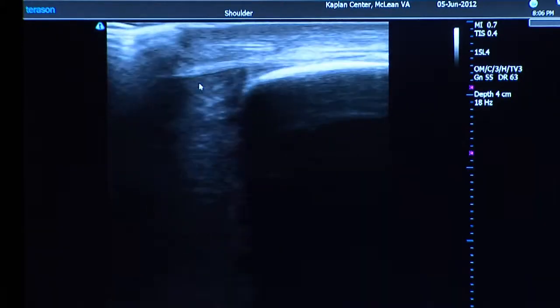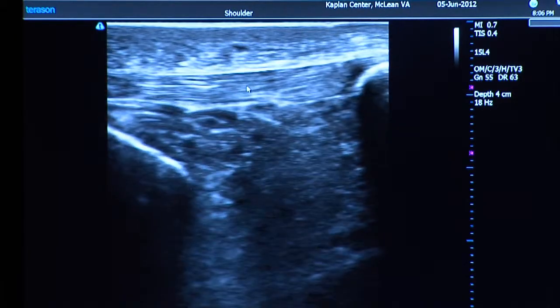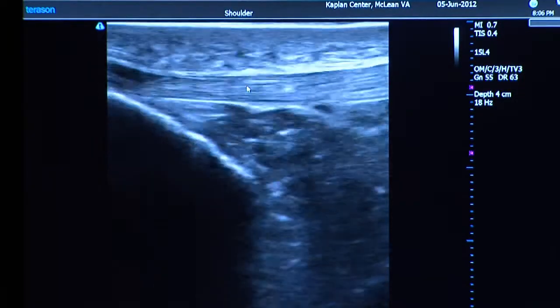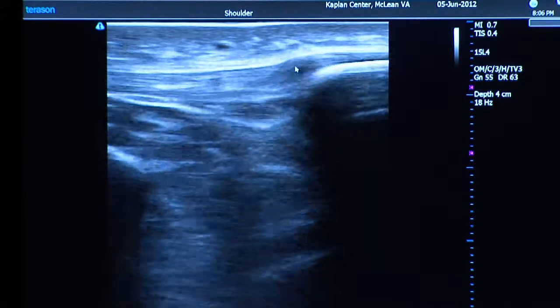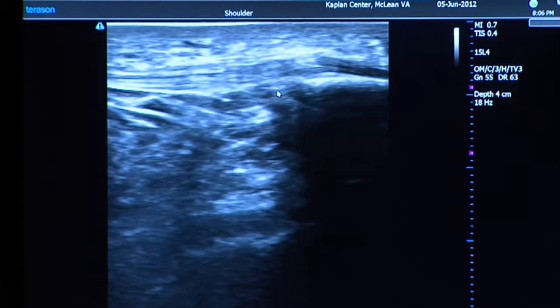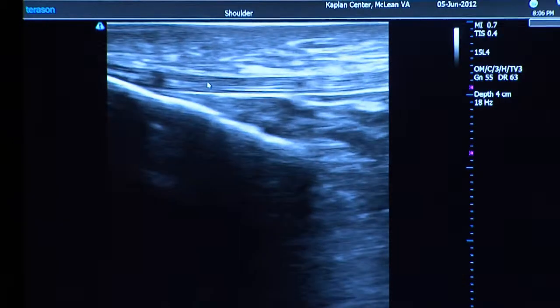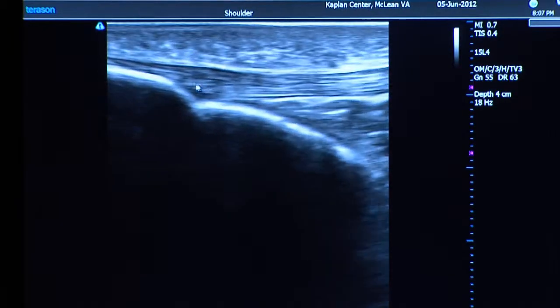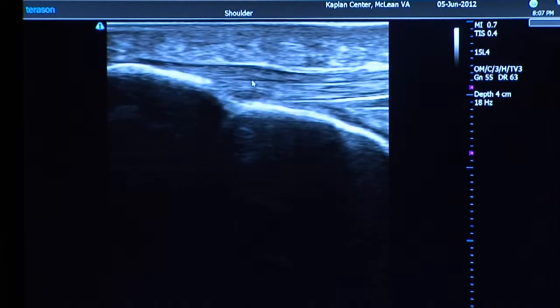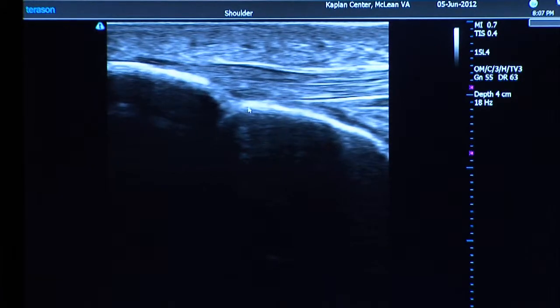We keep moving down and here is his patellar tendon. This is where people get jumper's knee — a very common place for problems, right at the tip of that insertion. You've got nice parallel lines right there, and looking all the way across that tendon it looks pretty good. It attaches down here on what we call the tibial tuberosity, and that looks pretty good too — maybe some very mild thickening but nothing significant.